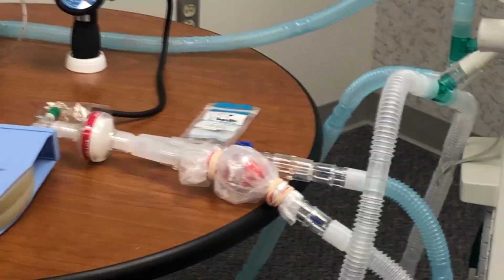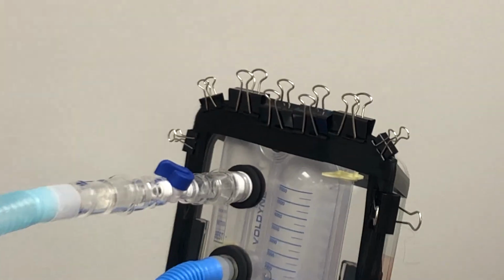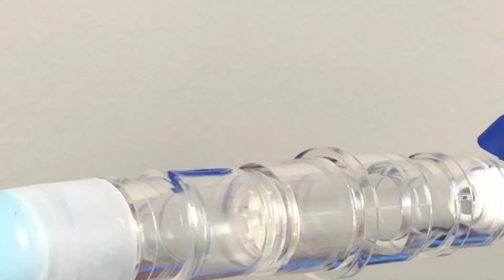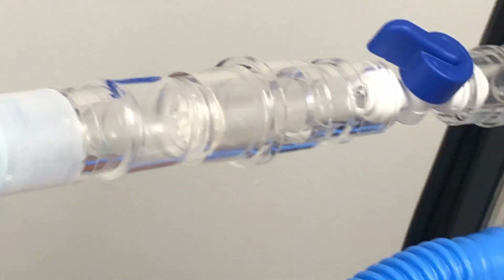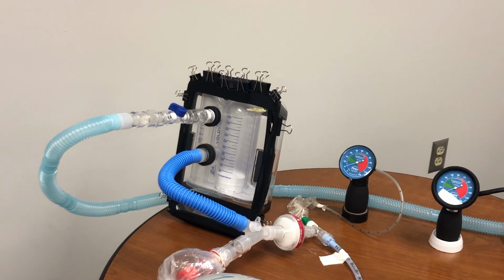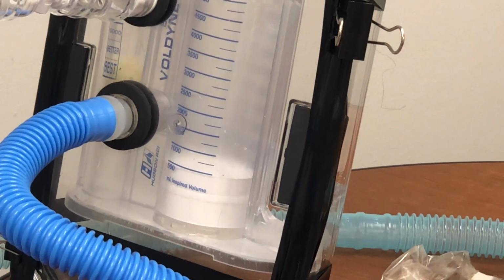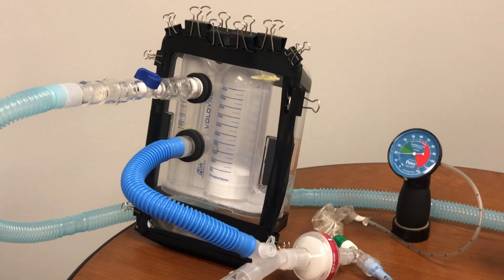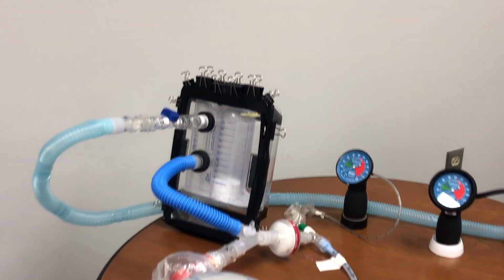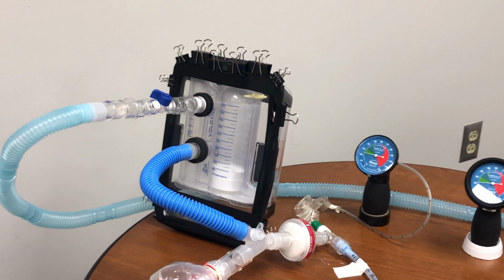So back to the ventilator. With these adapters, there's no other adapter used here. Of course, there's a one-way valve again here, like in the previous setup, and it goes to a modified incentive spirometer, and this is an optional equipment to measure the accurate volume, especially if you're ventilating a patient who has ARDS. And the way the setup is, one very important thing is it has to be airtight and rigid. That is very important. Otherwise, if air leaks, then this may not work as well, though it may still work.